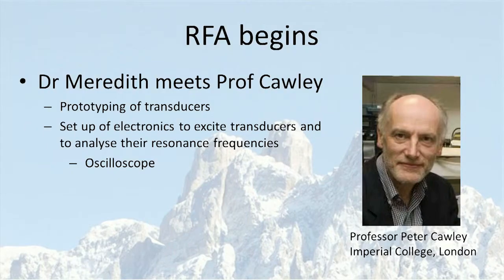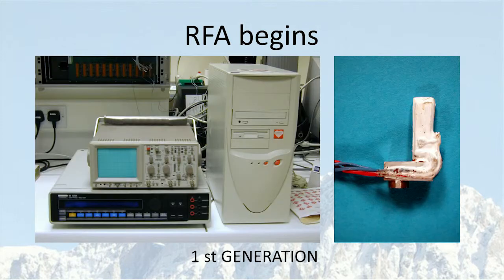So it means that at that time we were using quite big equipment, like an oscilloscope, a frequency response analyzer, and a huge PC. And this was the setup. I met Neil in 1992, and we decided to work together. So we brought this machinery into the Brånemark Clinic, where I was working at the time. And on your right-hand side, you see a prototype of a transducer which we used in patients. One measurement could actually take 5 minutes in the patient.